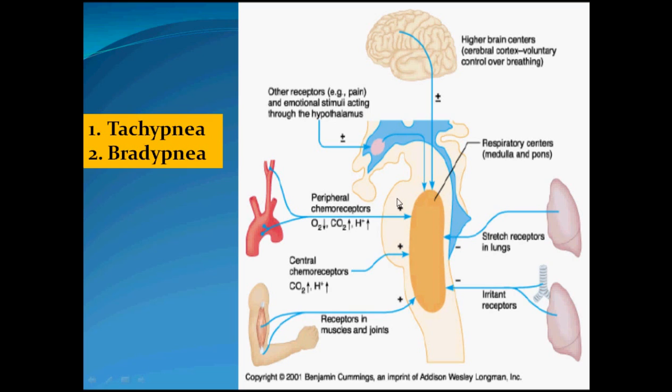So you put the patient on the ventilator, and at the same time, you do the job instead of the respiratory pump in order to avoid failure of the respiratory pump. In this case, you have to increase the minute volume in order to wash out carbon dioxide and keep the pH close to normal until you treat the underlying cause. So this is one of the mechanisms.